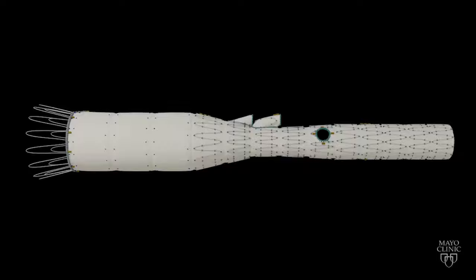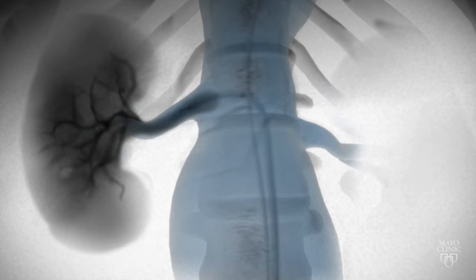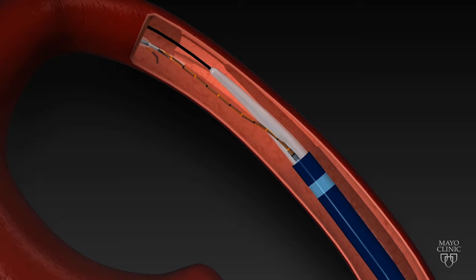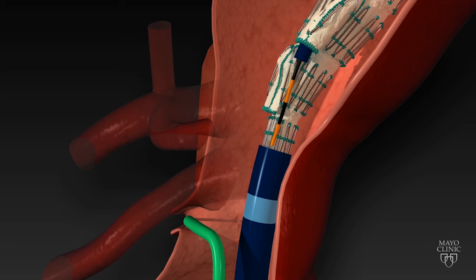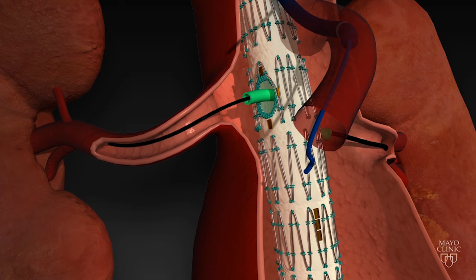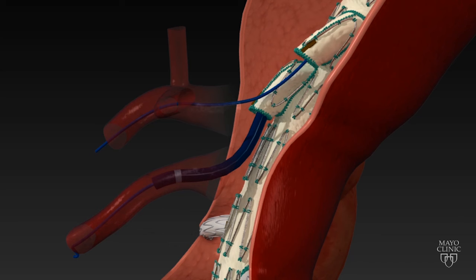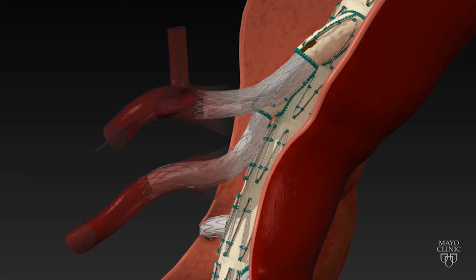The operation is done with small incisions in both groins. Working inside the arteries, we can obtain access to these vessels. In this segment of the video, a dye is injected into the right kidney artery to locate the vessel. Following location of the vessel, the aortic stent is introduced inside the artery with a delivery cannula and is released in the aorta. Working from the arm with catheters, we can access the small cuffs into the arteries of the liver and intestine, while the arteries to the kidneys are accessed from below. Once all vessels are safely secured, separate side stents are placed into these arteries, followed by an additional stent to connect the repair to the arteries that go to the legs.